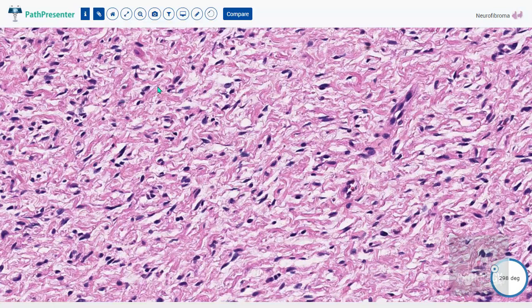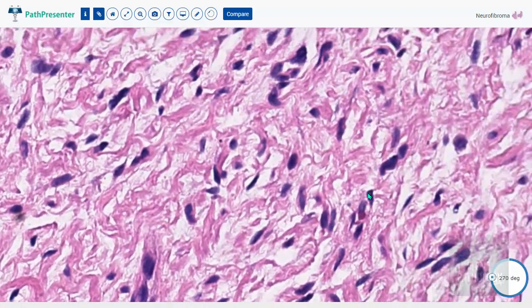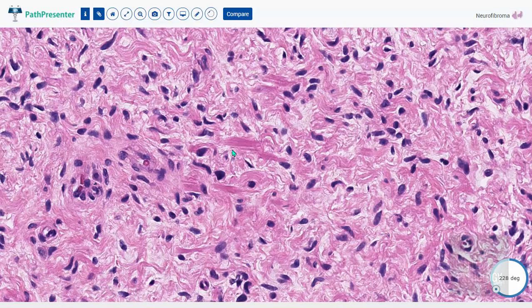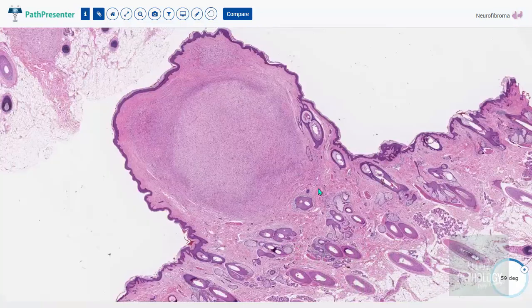Under higher magnification you can appreciate the collagen. This is a thick collagen band, and these are thin collagen strands. A combination of thick and thin collagen is what gives the shredded carrot collagen appearance. So neurofibroma is essentially a dermal tumor — circumscribed but without a distinct capsule, only very rarely extending into the subcutis.